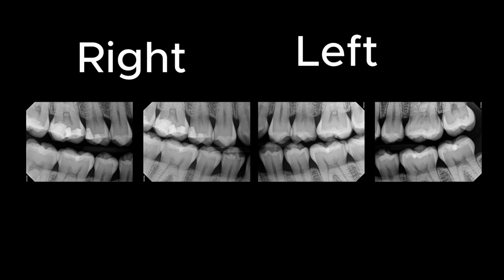They have the bone levels showing, but one thing we're looking for is 2 millimeters past the second or farthest back molar in the mouth. On the right side, they didn't quite get back behind that last molar enough, and you can't really see what's going on there in the image. On the left side, they did a great job of getting a few millimeters behind the distal of the last molar in the mouth. So on the set of x-rays here, the left side molar is a great view, and the right side premolar is a good x-ray.